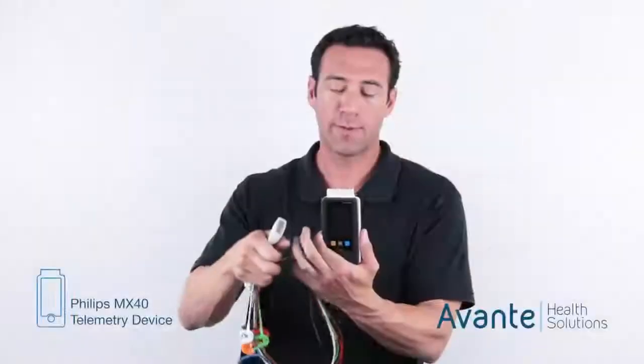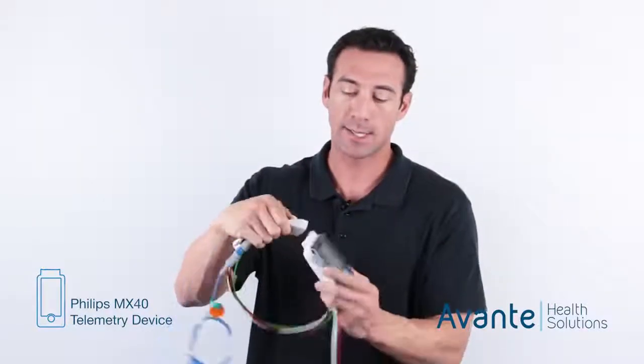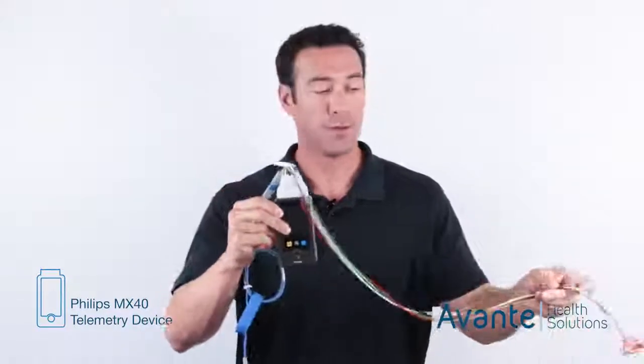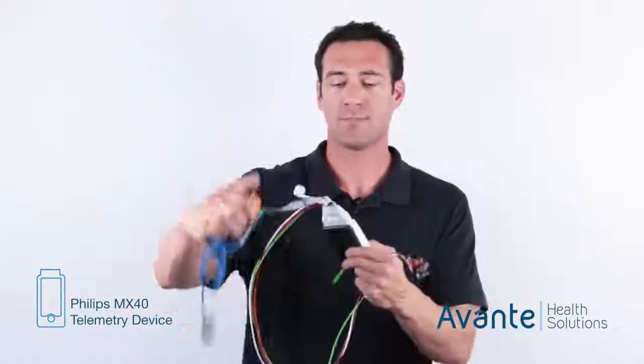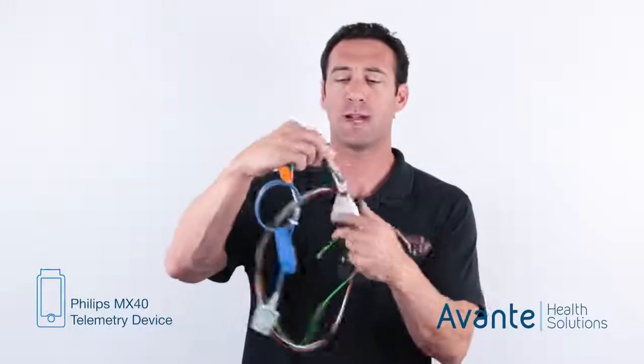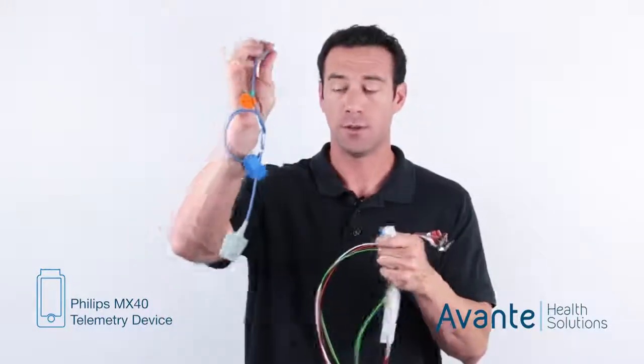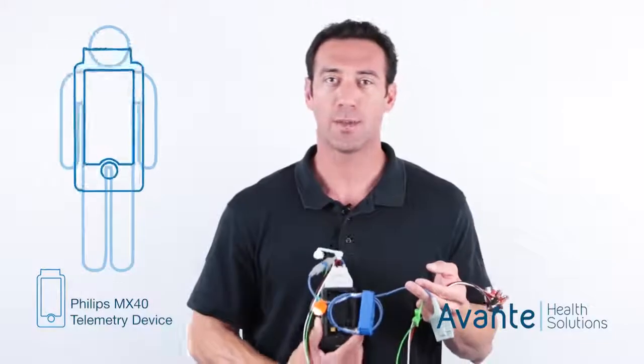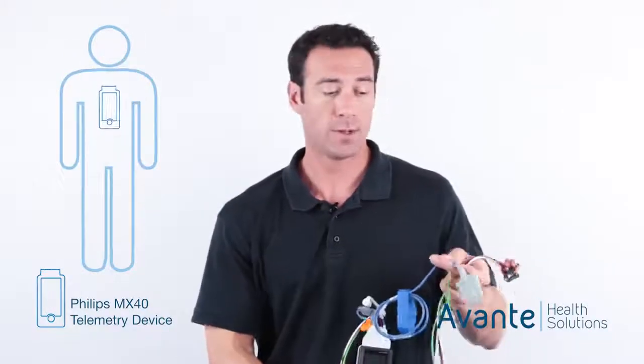Much like the other Philips products, you have the patient cables. They plug right into the top, and you have the ability now, on this unit, to run the ECG, so it'll be connected via electrodes to the patient, and it has this little piece or dongle that comes off and allows you to run your SpO2 finger probe. So again, it will be patient worn in the necklace or in the bag, a lot of times in a gown as well, and then it will just be run to the patient's finger.